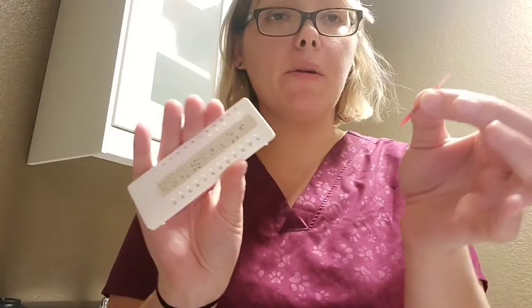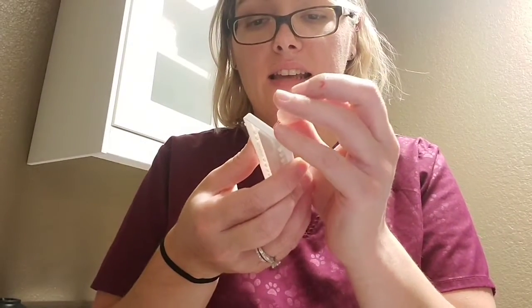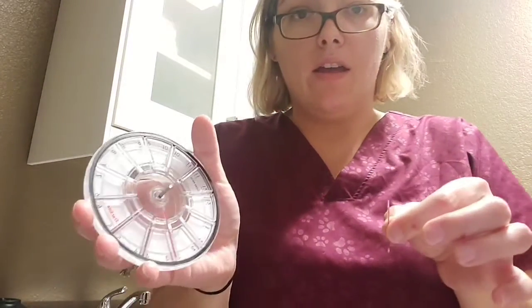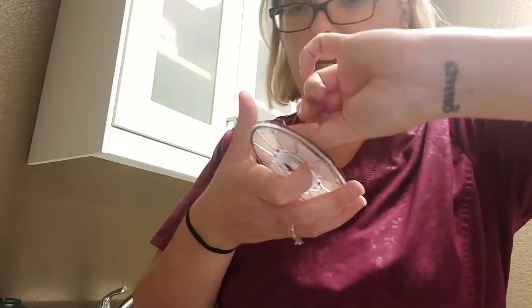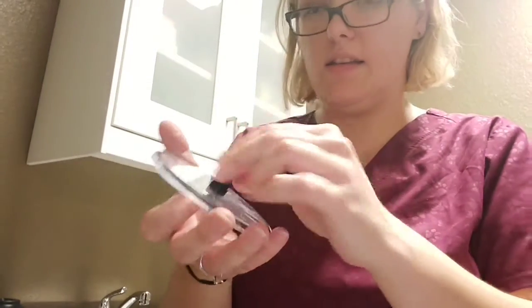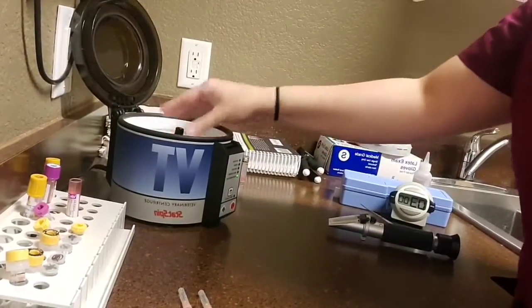That looks about good. So from there, I probably should be wearing gloves doing this. But I'm going to go ahead and plop this in my clay to close off one end so that when we're spinning we don't lose everything at the end. And then I am going to place these inside of our attachment here, with the clay facing outwards and balanced, and then we'll close this and stick this over here on our machine.